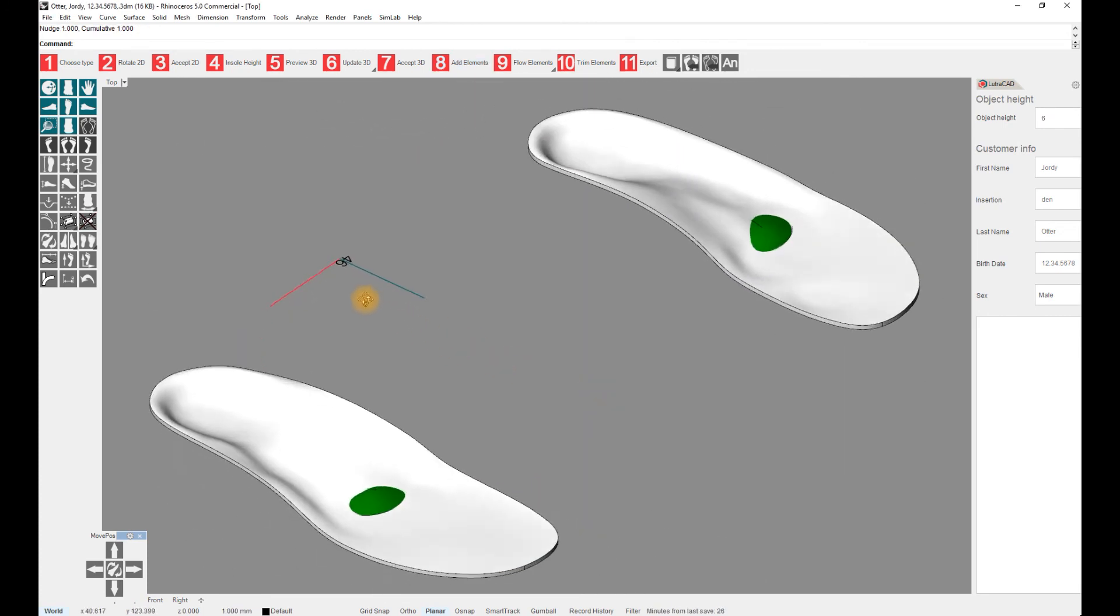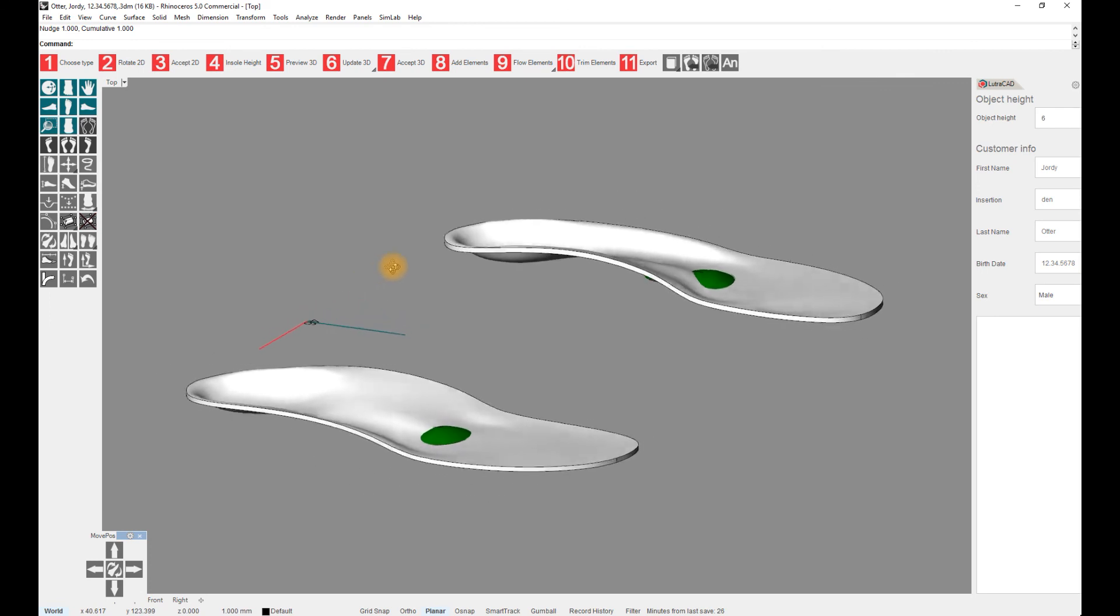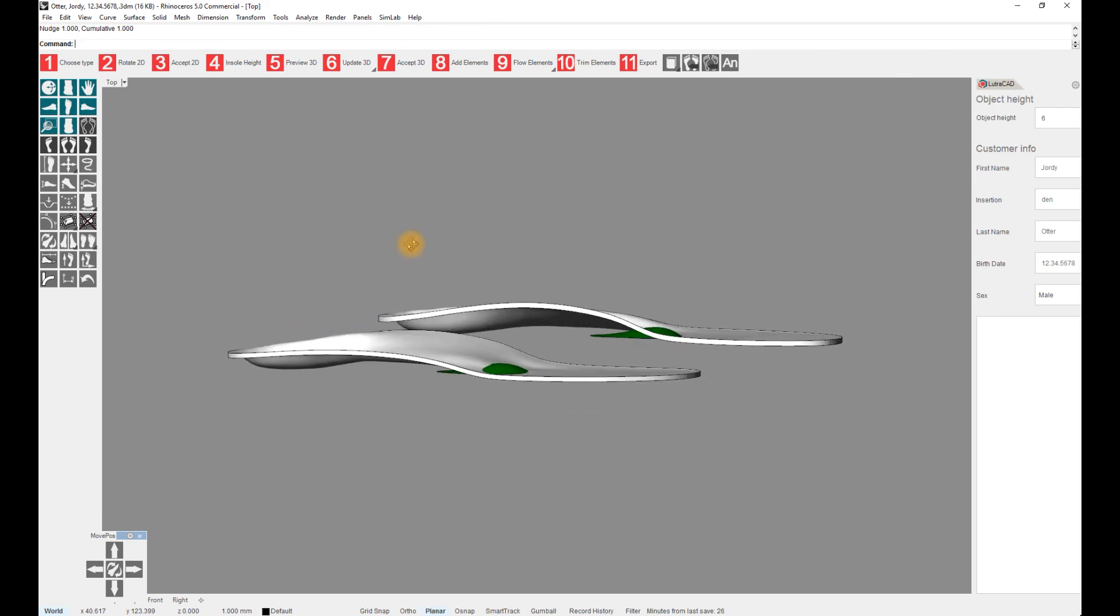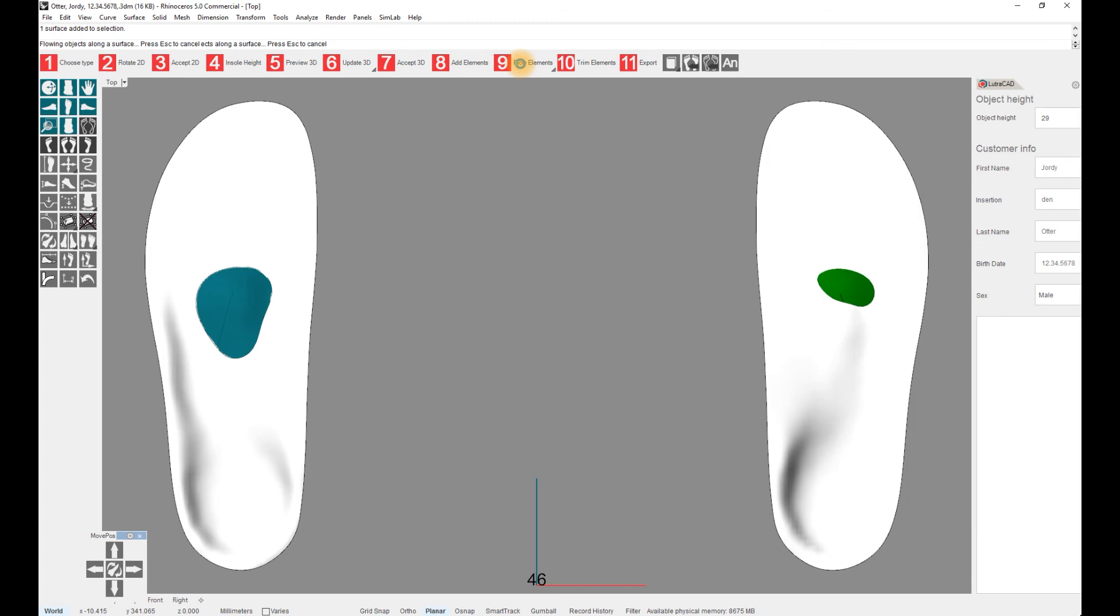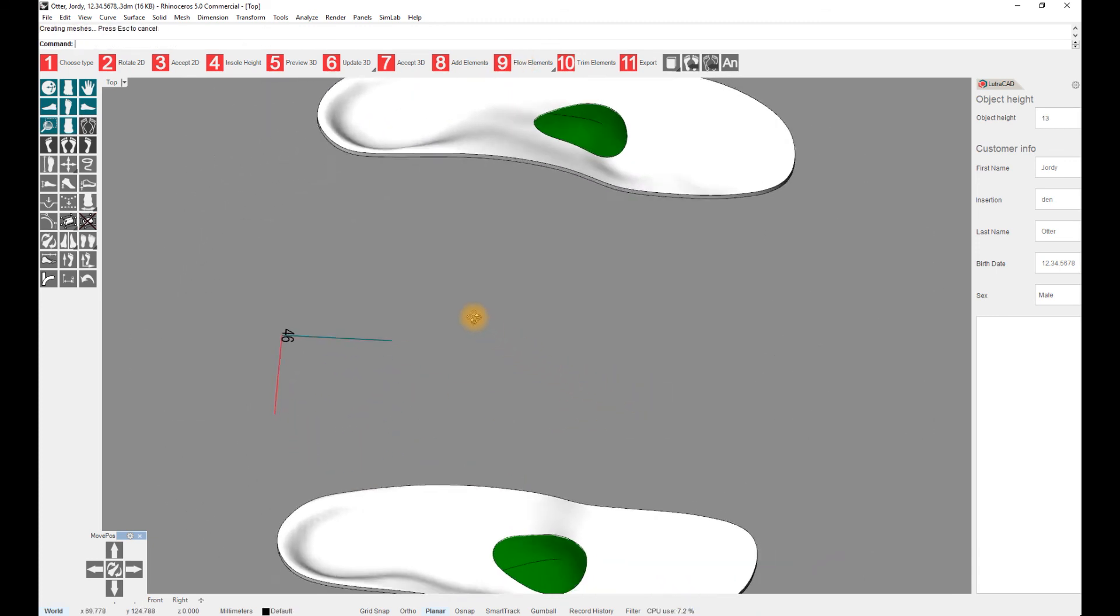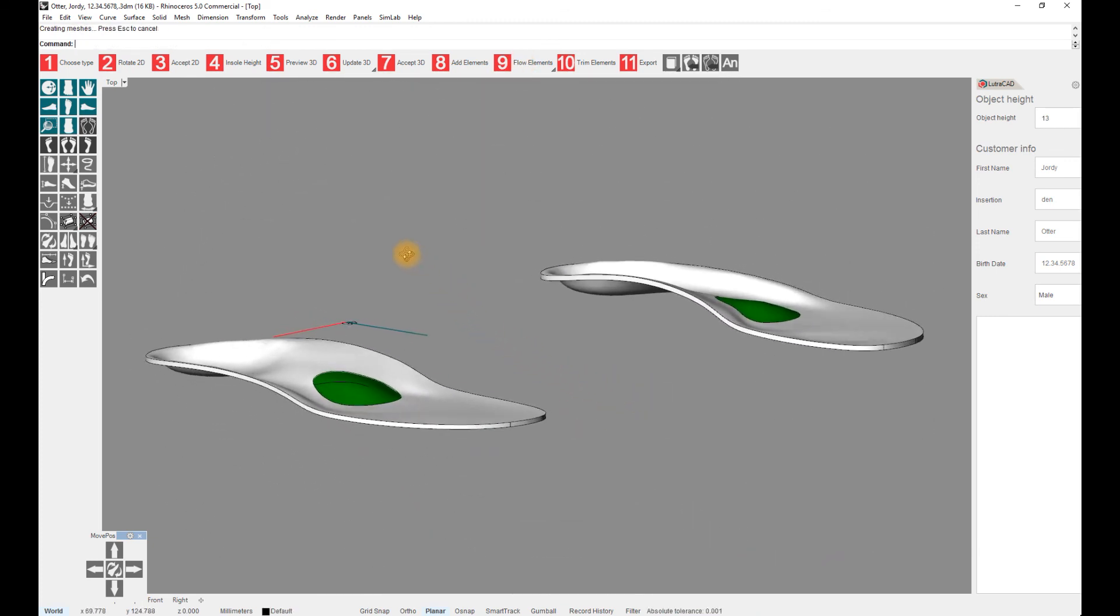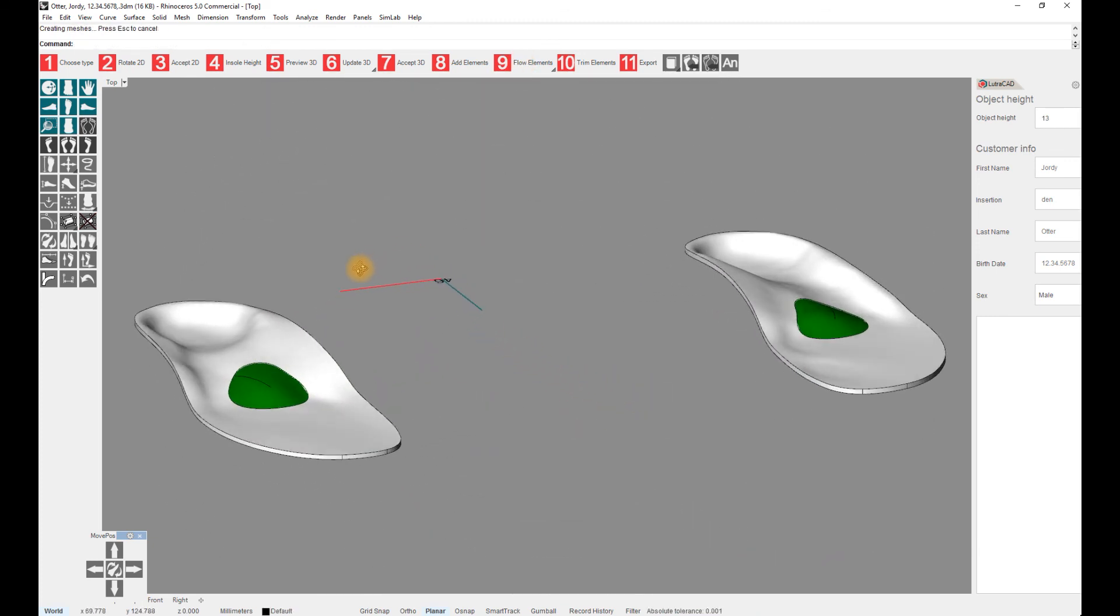As you can see, the element's position starts on the ground and can be adjusted to the right height with step 9, Flow Elements. This will automatically lay the element on top of the insole just like you would if you did it manually.